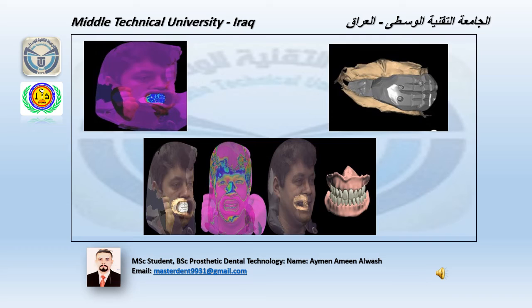أما بالنسبة للصورة اللي موجودة بالوسط ف free scanning with the occlusal rim being placed on the mouth where it performed with natural face, smiling face and cheek holder. يعني راح نسوي بعدين scanning لكل الفيس حتى يصير عندنا 3D scanning for the patient and complete data will be transferred to software.